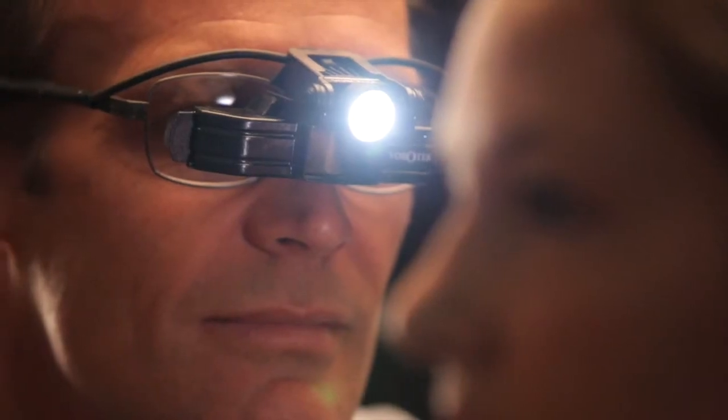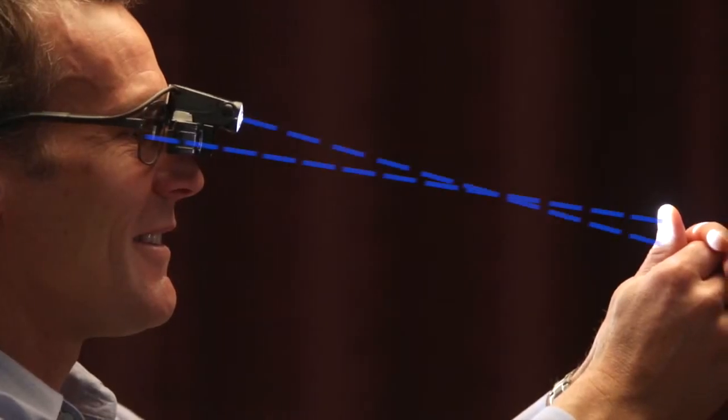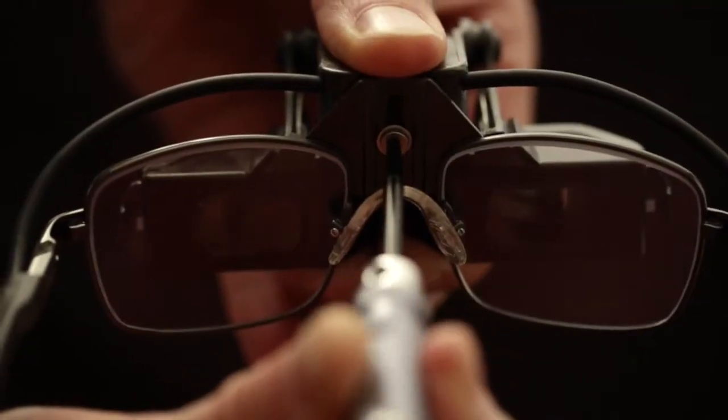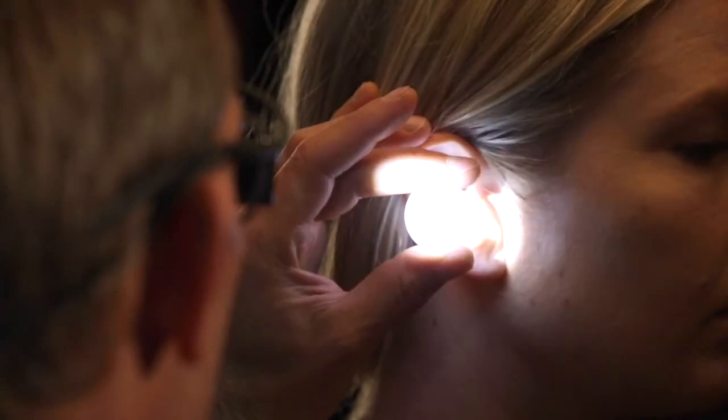If you find the light spot isn't aligned with your visual pathway — for example, the light is too low — the integrated system will need to be moved lower in the spec frame slot. This adjustment may be required to make sure the light spot is correctly aligned.